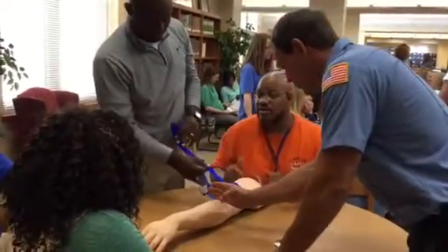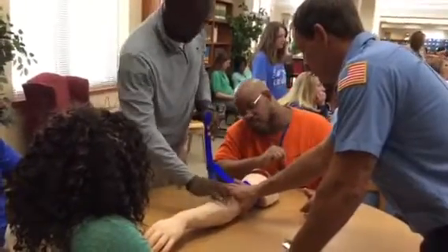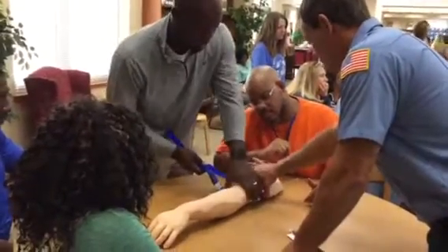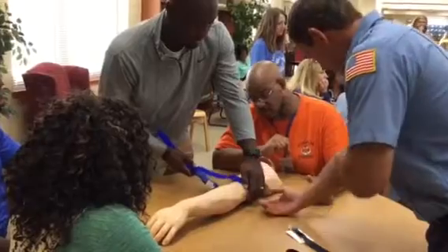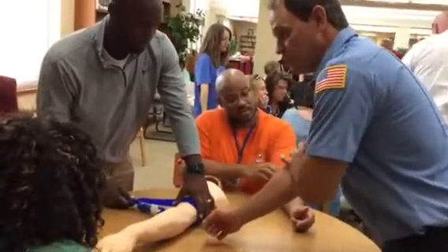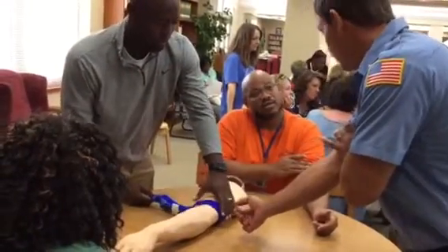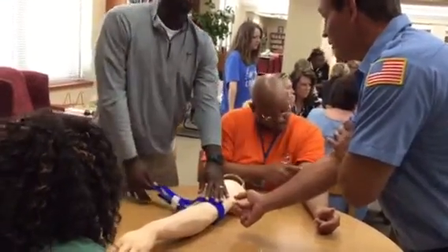You want to be close to each one, so you're going to be up here, not here — come close to it, closer. There's less muscle to it, so you can actually do more compression in this area where there's less muscle. If you get on top of the muscle, you can do it, but you're going to have to tighten it really, really tight.